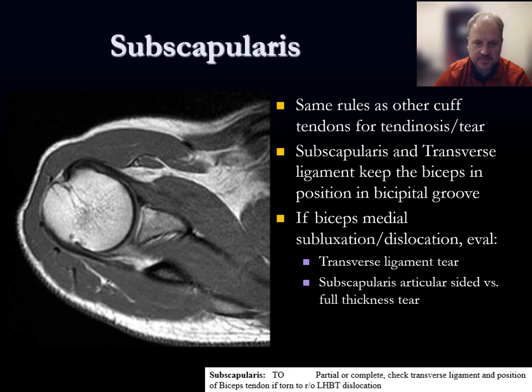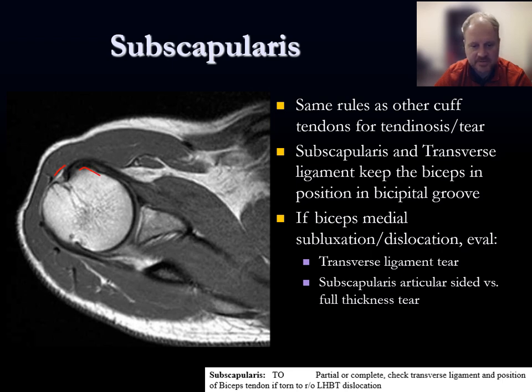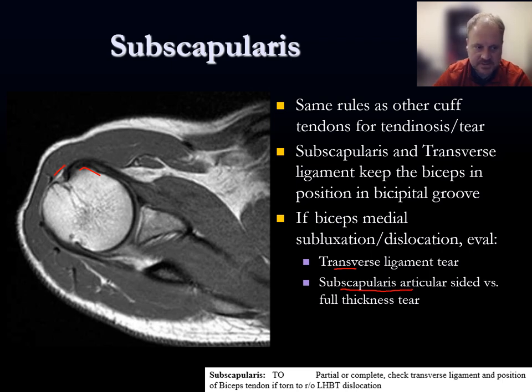Near the subscapularis there are other important structures that maintain the architecture of the shoulder, particularly keeping the biceps in the bicipital groove. The transverse ligament crosses the roof of the bicipital groove, and the subscapularis is immediately adjacent. If you see medial subluxation or dislocation of the biceps, those adjacent structures — the transverse ligament and/or the subscapularis — are likely also abnormal, since they are what normally prevent the biceps from dislocating. An articular-sided or full-thickness subscapularis tear can allow the biceps tendon to jump out of the groove and even locate in the glenohumeral joint.